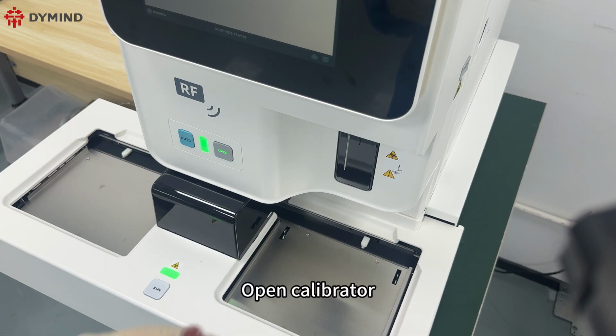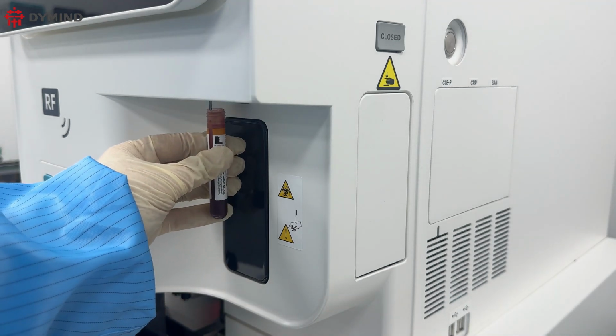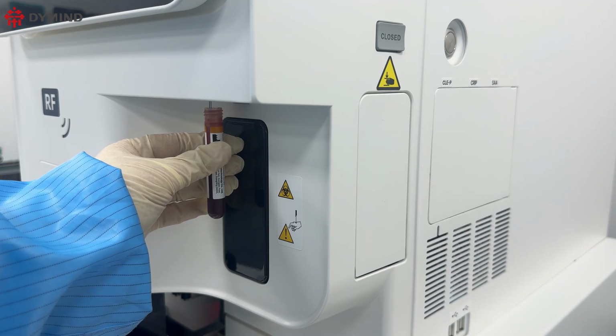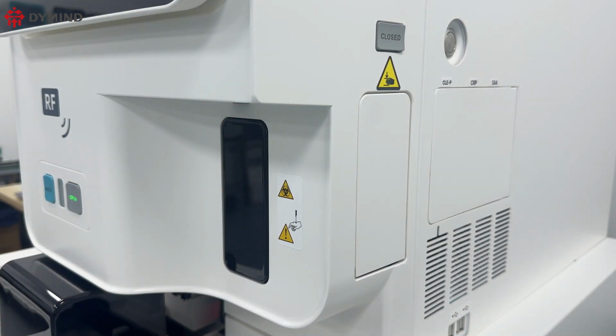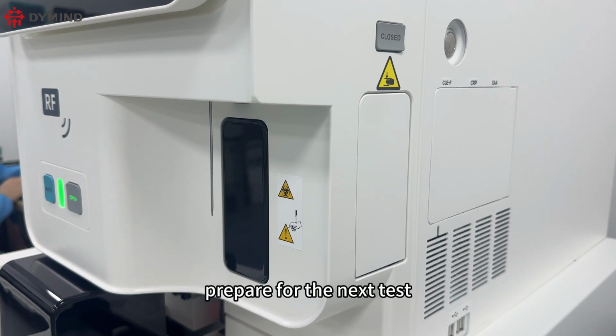Open calibrator. Place it under the sampling needle. Click the Open Mode Aspiration key. When the needle reappears, prepare for the next test.